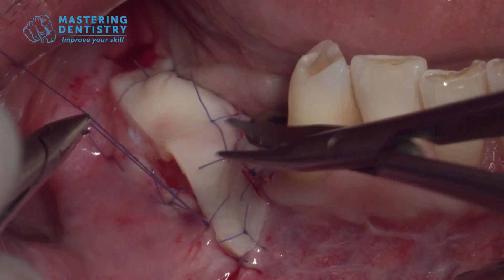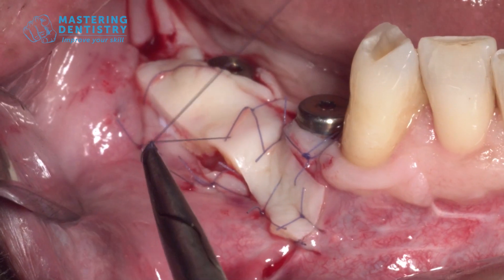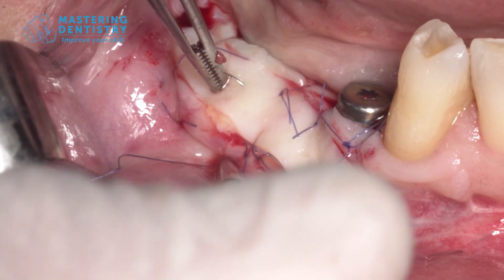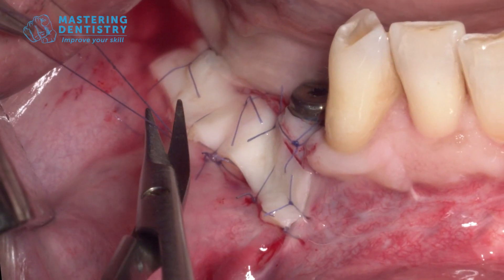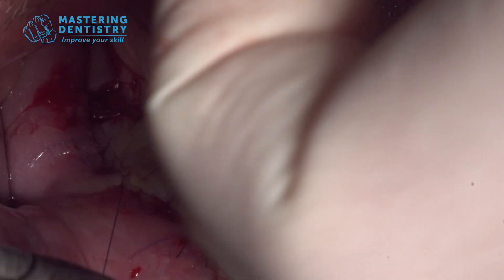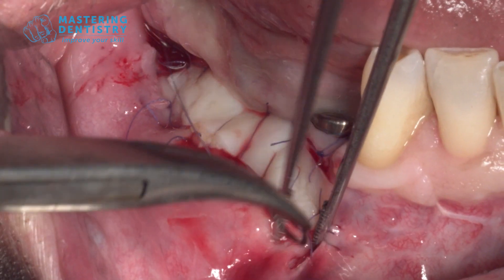When we go to the apical part, we can start from the primary flap we have fixed in the apical position in the first step. We go through the primary flap, through the periosteum, and then through the graft, so when we tie the knot we fix all together and push everything toward the periosteum — both the primary flap and the graft. Once we have gone all around the graft, we can push the graft toward the recipient side with some sling sutures.